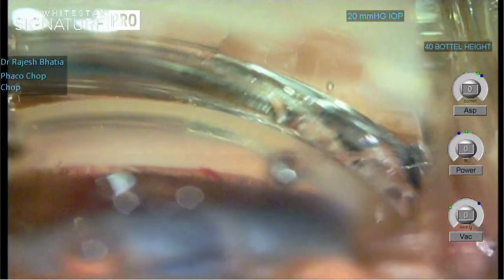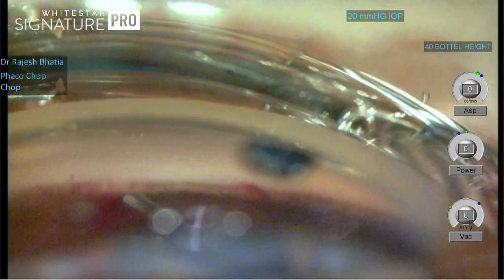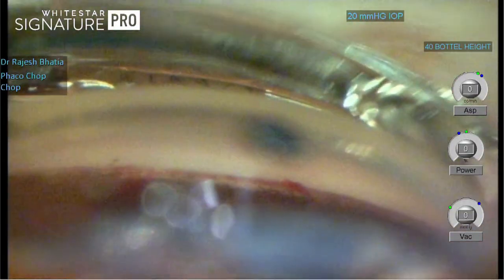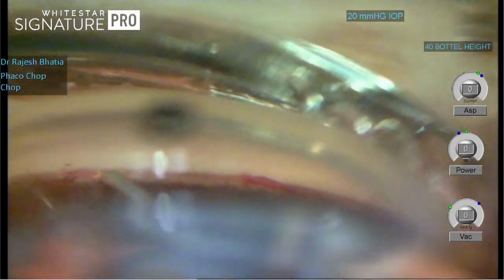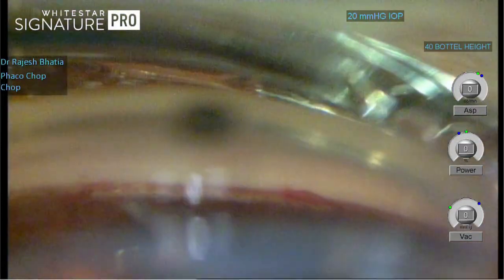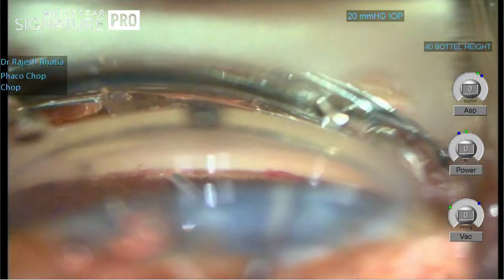So this is the area of the first eye stent. Is it centered? Now both the stents have been placed. I'm making an effort to show where they are. So this is the area of the first eye stent. Here, this is where it is. Is it visible? I think you have to just zoom out, then they can see. Zoom out a little. Okay. So here it is.